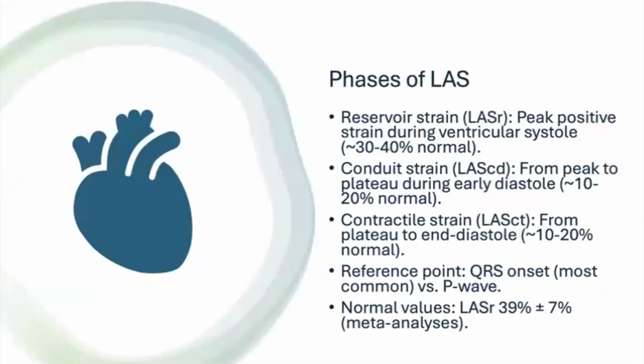So now on more specifically to left atrial strain. When calculating myocardial strain, it's common to use what in the mathematics and physics world is known as the Lagrangian description that uses end diastolic length as the reference, hence why in LV global longitudinal strain, we're dealing with negative numbers, because the LV cavity is becoming smaller. Initially, in myocardial strain, they used what's called an Eulerian description, where they used the deformed myocardium as the reference, and so they were dealing with positive numbers, but over time, the convention has been to switch to predominantly the Lagrangian convention.